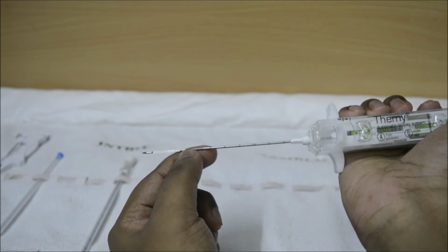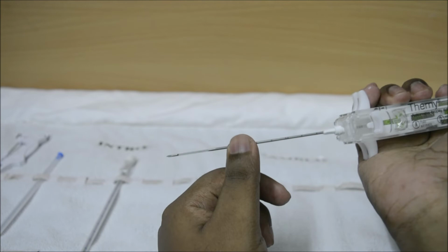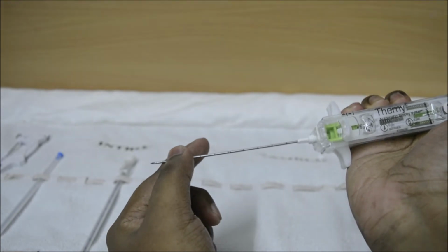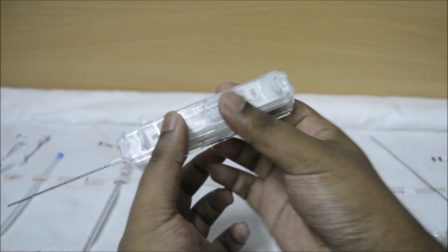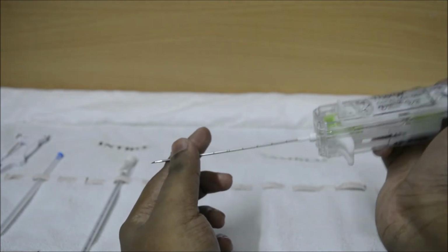Now you can see as I pushed once, the sample collection tray got outside, it got exposed. So that means unlike the semi-cut or hand cut, I don't have to push the needle ever. It does it automatically. Now since the sample collection tray is outside, it will be pushed again and the tray will be closed. And it can be performed so fast that this procedure happens like this. And the sample is collected and trapped inside the needle.